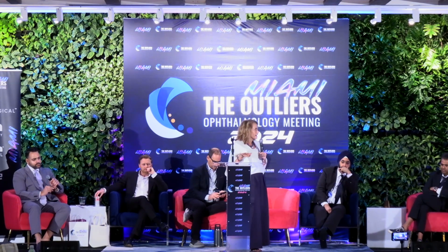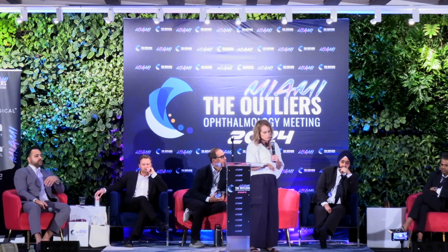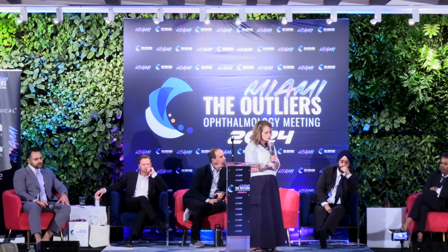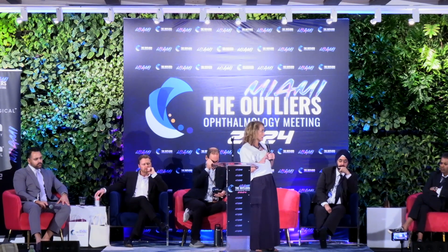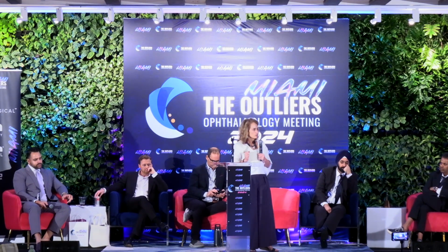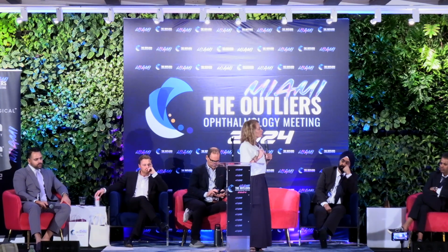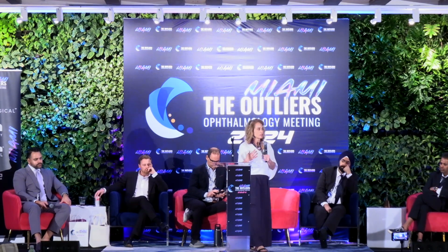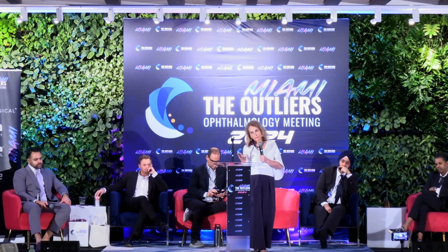So why is that? What does it do to quality of vision? Well, here you can see in patients with normal osmolarity, all of these light scatter indices are normal. That is not going to contribute partially to their quality of vision. But if they are hyperosmolar, and that's like 326, you'll see that there is this light scatter equivalent to having a grade 2 to 3 cataract. Well, we would be taking that cataract out to improve their quality of vision.